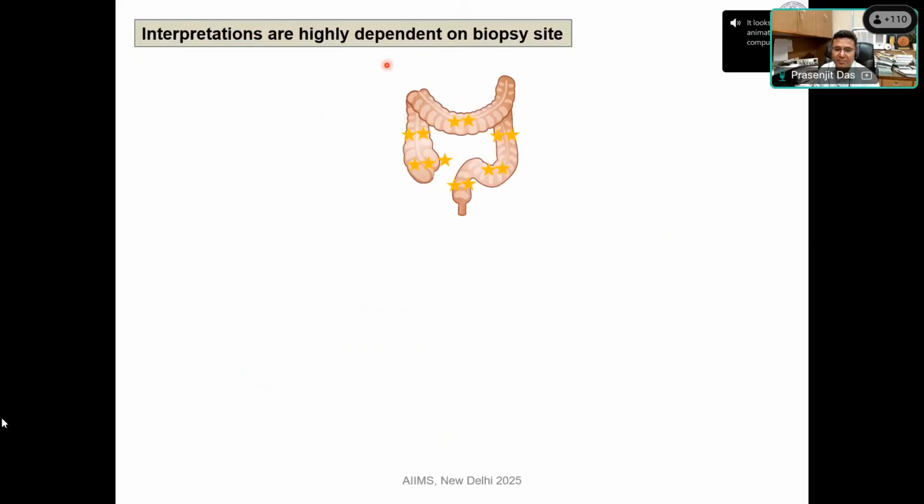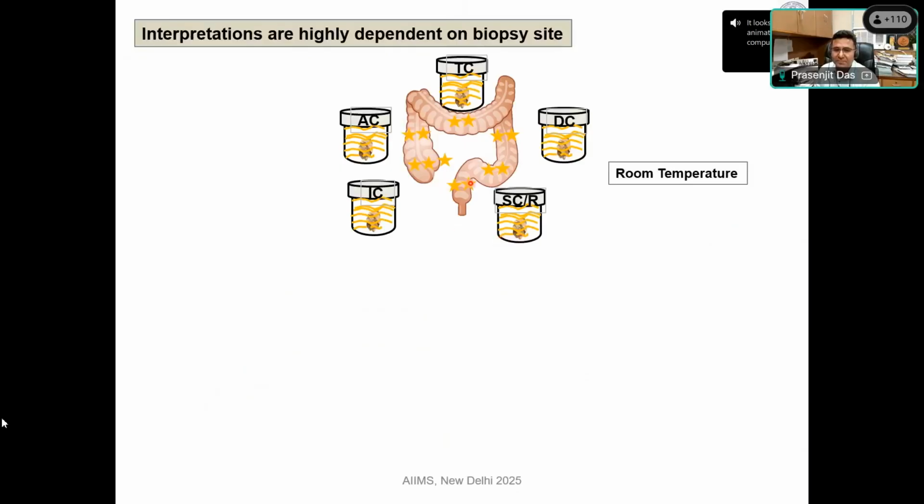algorithm, and the interpretation is highly dependent on the biopsy. Always we have to discuss with our clinical fellows. The importance of segmental biopsy I have already told, and it is always better if all these segmental biopsies are separately labeled and sent to you, and you then report separately for each segment. Okay, if it is chronic active here, basal plasmacytosis is present or not, like that everywhere, and granulomas are present or not, then you give a final interpretation.